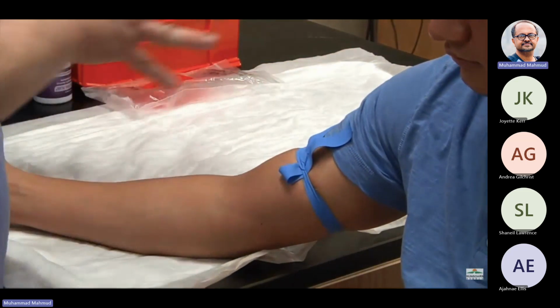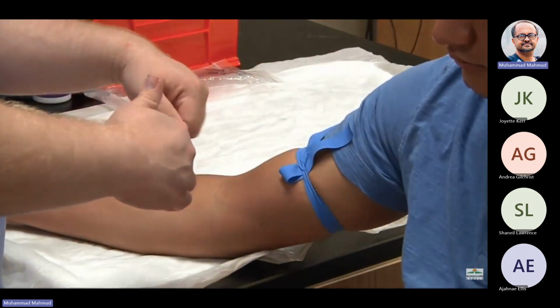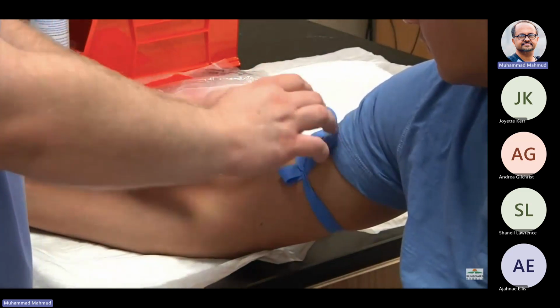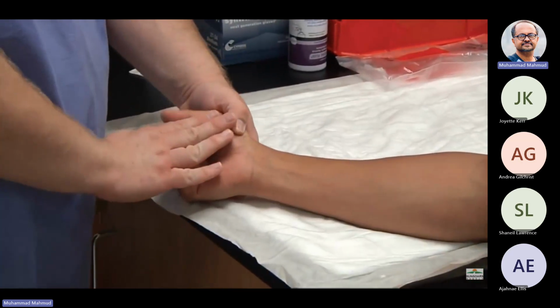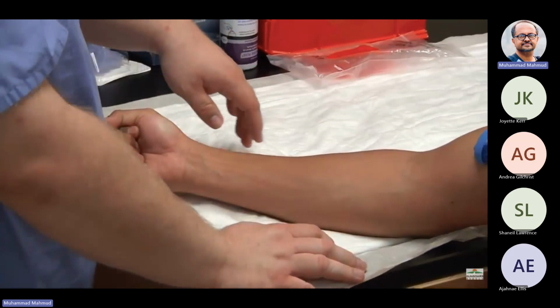Remember, we always want frog legs up, bunny ears up, not frog legs down. So we have our tourniquet in place. It's nice and smooth and flush. We just need a little bit of constriction to get the veins to pop up. So you can ask your patient to make a fist. You don't ask them to pump their fist, just make a fist, and this will help in finding the veins.